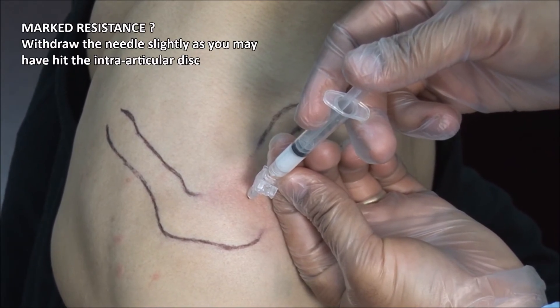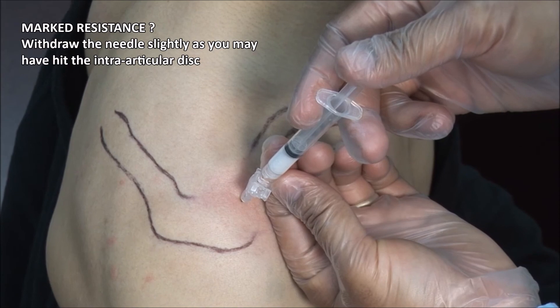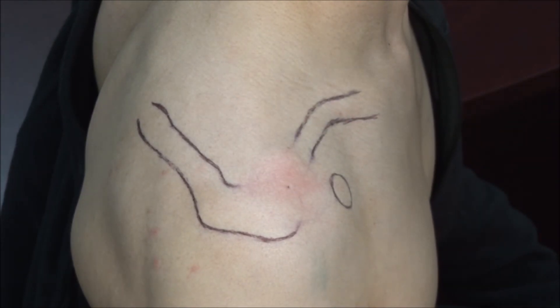If there is marked resistance, you may have hit the intra-articular disc and you should withdraw the needle slightly. Finish off by drying the site and applying a bandage.